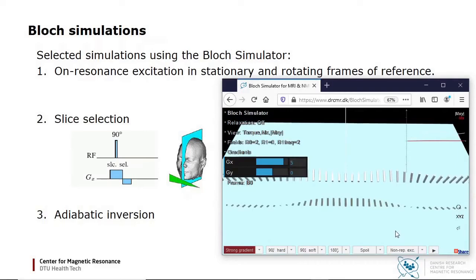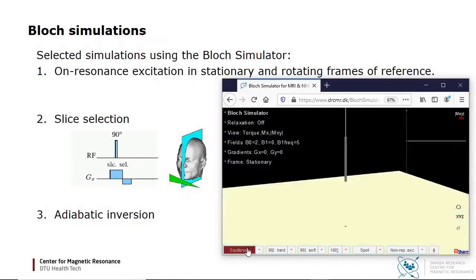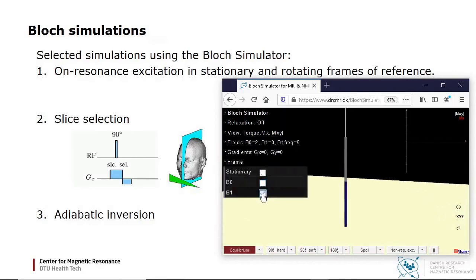To give a better impression of the effective field vector, I will now show so-called adiabatic inversion, used to apply 180 degree pulses fairly independent of the B0 and B1 amplitudes. The idea is to start the RF pulse far from resonance and then do a frequency sweep through resonance. I start in equilibrium and go to the rotating frame.